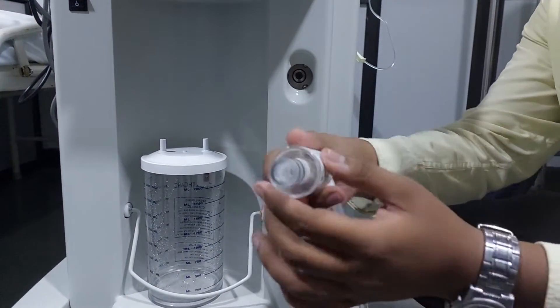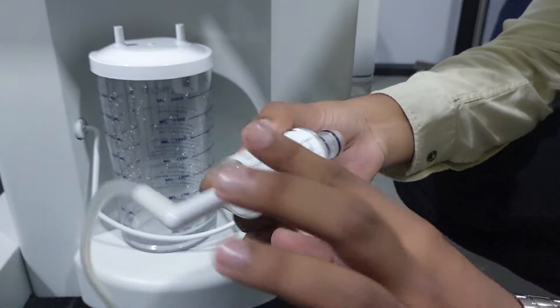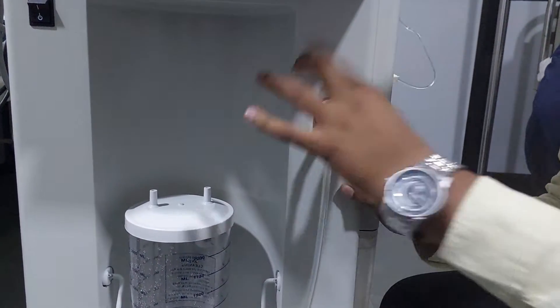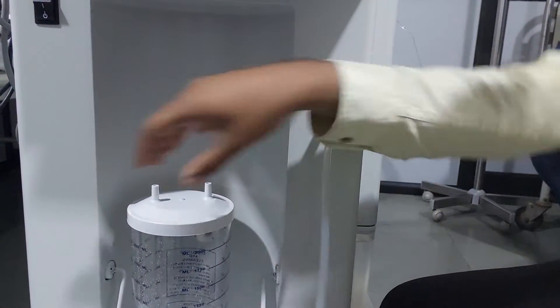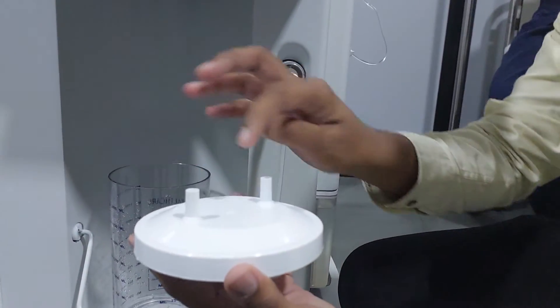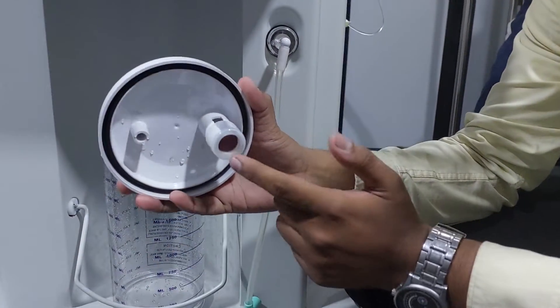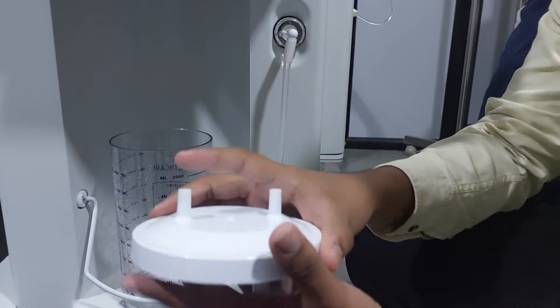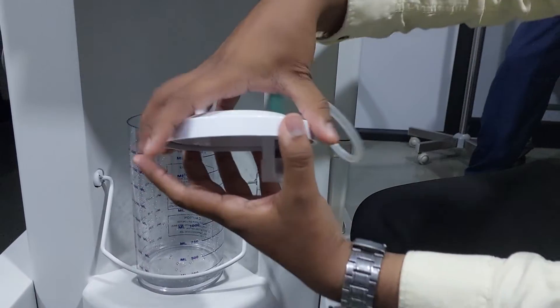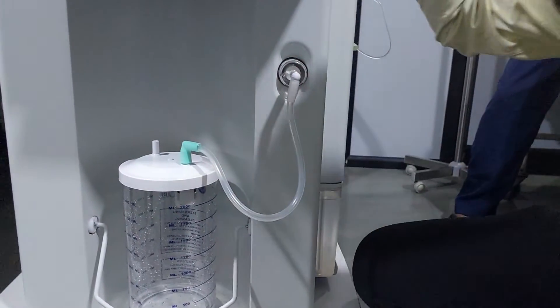How to fix the filter to the jar: you can observe. Whenever you are going to replace it, you have to always mention the date. To fix it, just keep it and push it. For the jar, there are two openings — one is inlet, one is outlet. They have provided one wall here; you have to always fix this at the wall side. This is the first thing we have to follow.